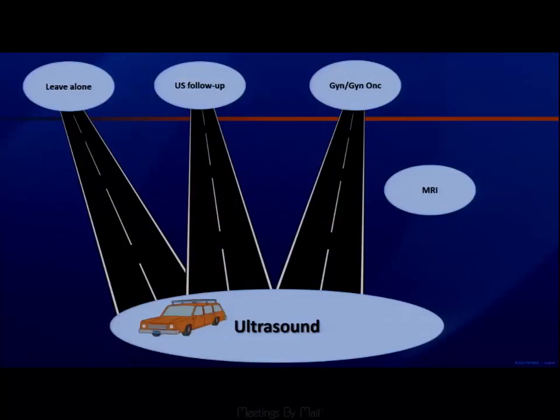So here you are, you're sort of steering the car when someone's there for an ultrasound, and you have to decide whether something's going to be left alone, see ultrasound follow-up, go to GYN or GYN-ONC, or whether MRI has a role somewhere in these pathways.